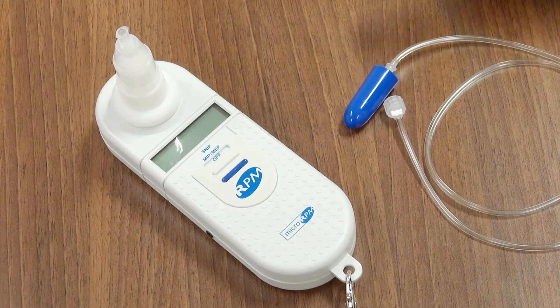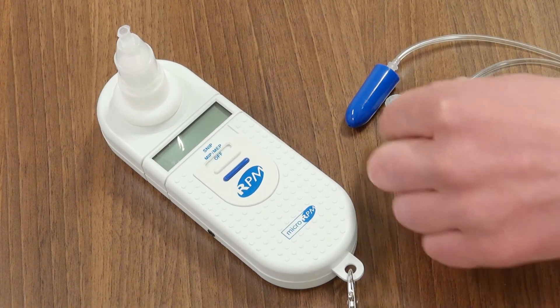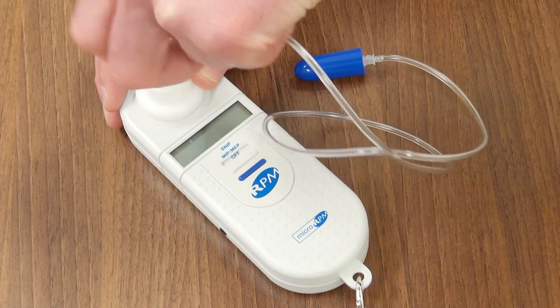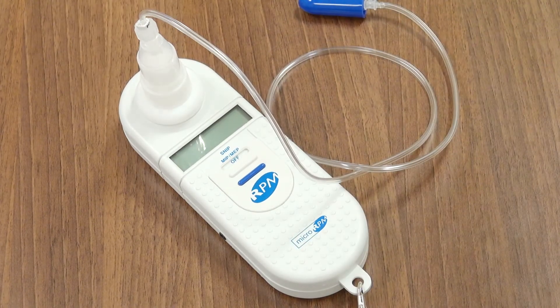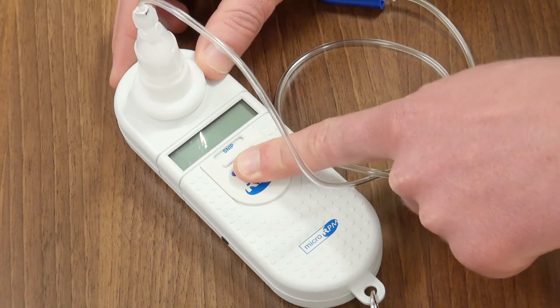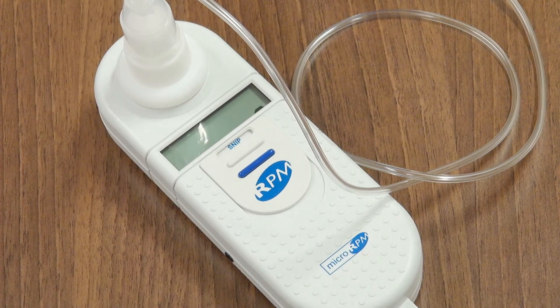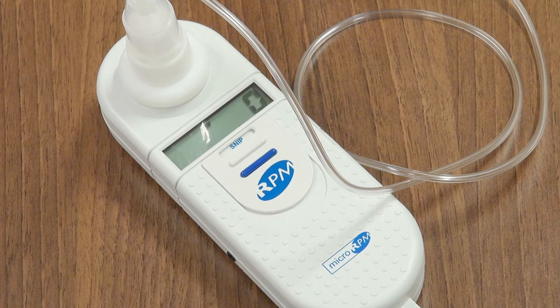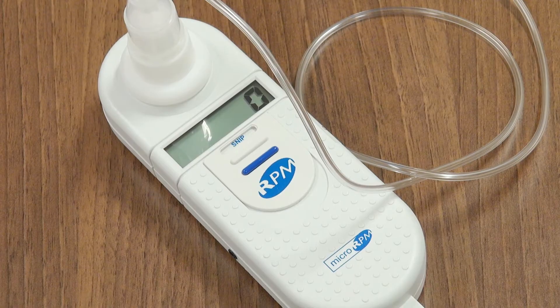Once you have selected the correct nasal probe, attach the nasal probe to the device. Now, switch the device from OFF to SNIP. Wait until the screen of the device shows a zero. Once this is complete, the device is ready for the test to be performed.